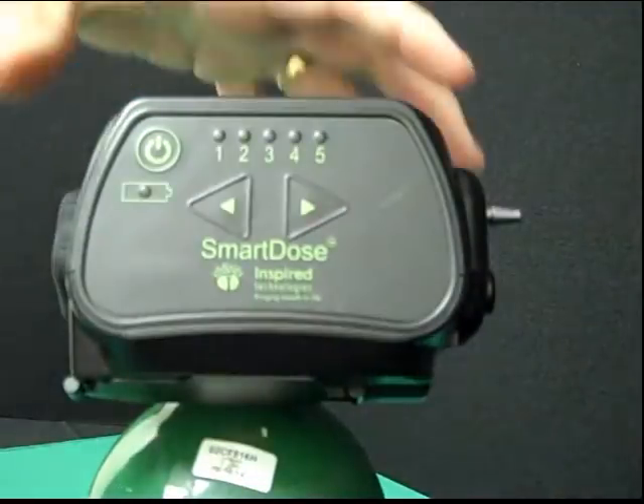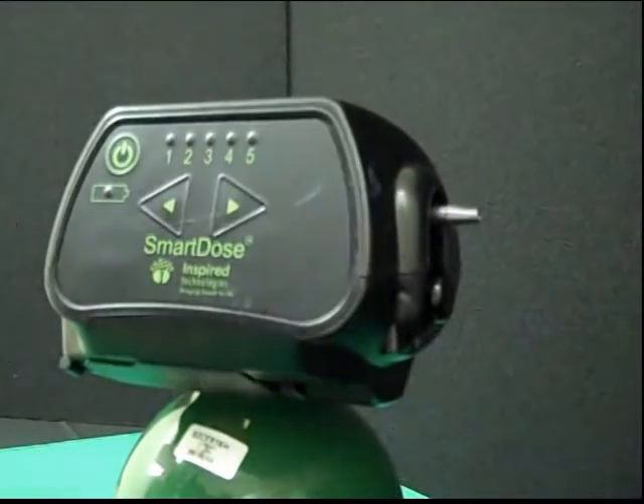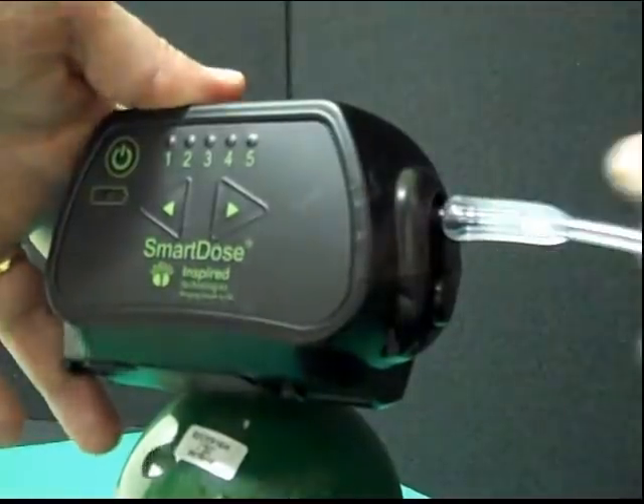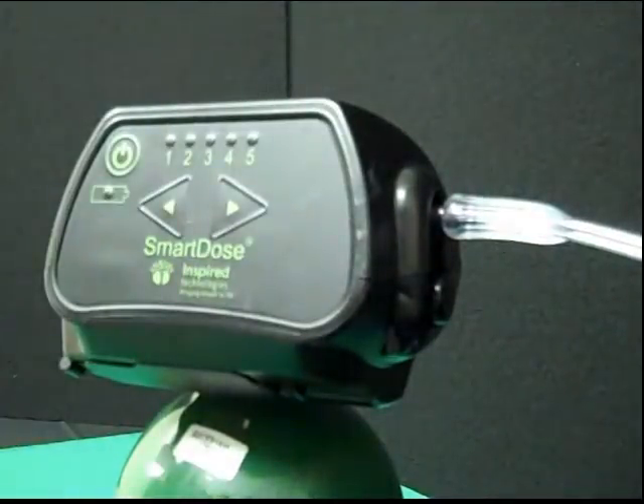Looking at the side of the unit, the barb fitting is where the patient cannula is connected. Simply push single lumen oxygen tubing firmly onto the barb, turn the unit on, and start breathing.